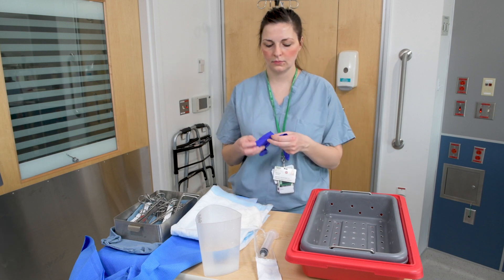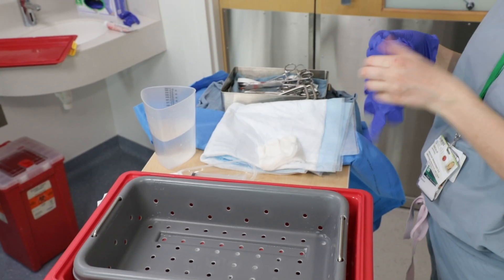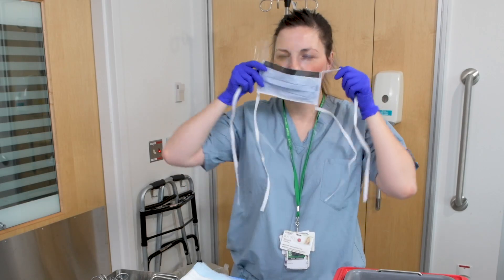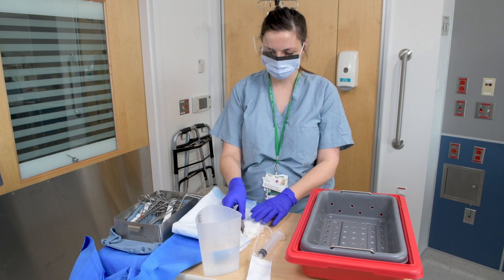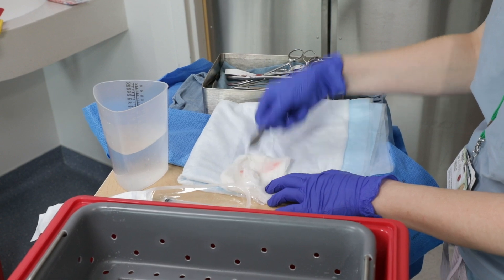For appropriate steps for pre-cleaning with the HumiPak system, immediately after the procedure, don gloves and eye and face protection. You can use a mask with a face shield or mask with goggles. Begin by placing a chucks pad or gauze onto a solid surface. With the sharp end pointed away from you, utilize the bread and butter method to remove gross soil from the solid instrumentation.